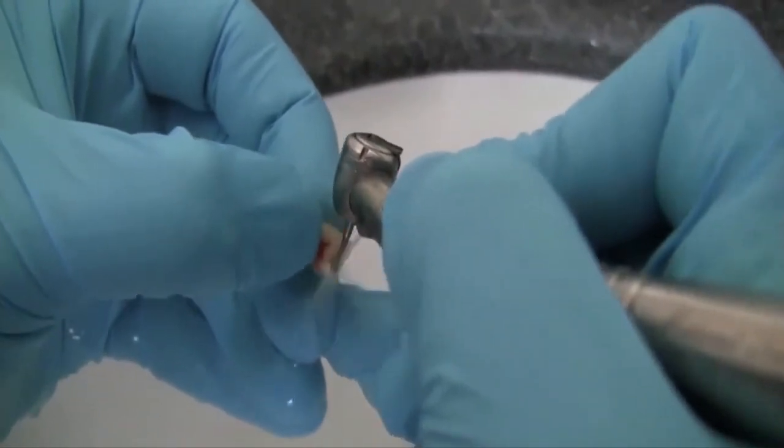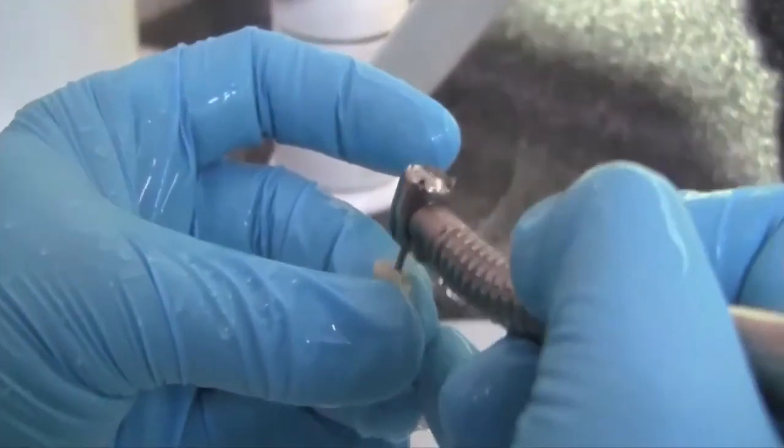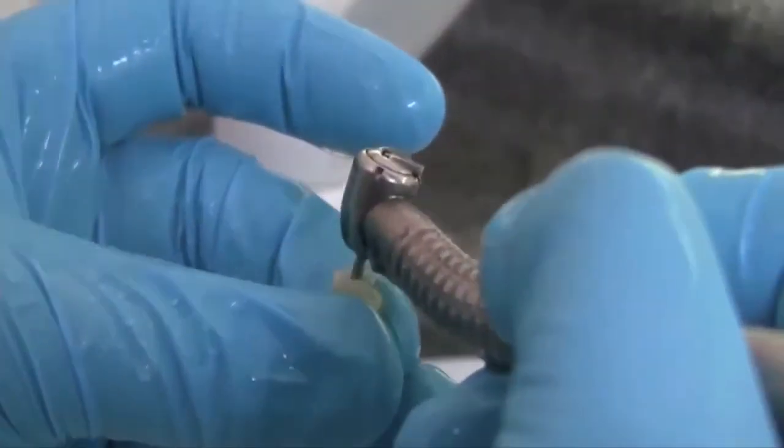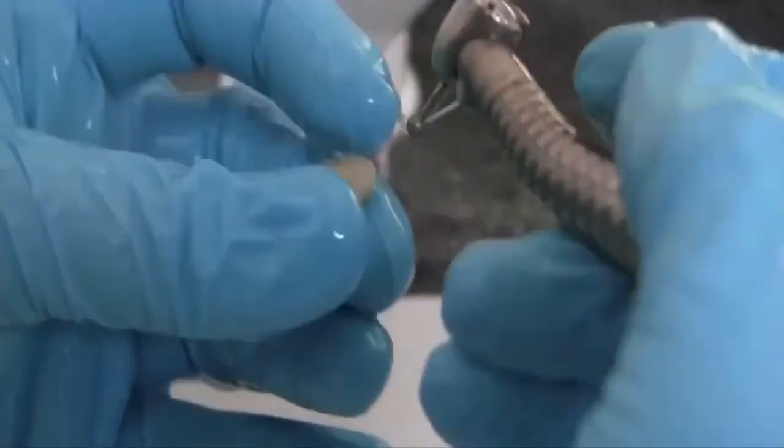Once the root is separated, we proceed to hollow that root utilizing a round burr, and it's very important to leave some layer of dentin surrounding the tooth, especially in the facial part, so that dentin can serve as an opaquer, because remember that we're using a metallic temporary abutment.